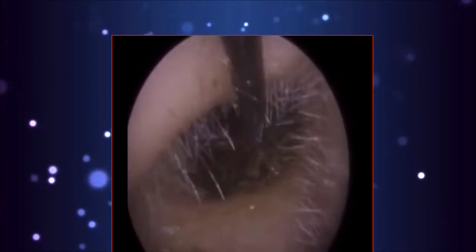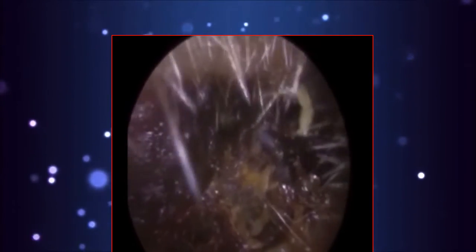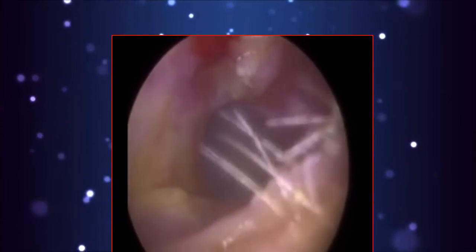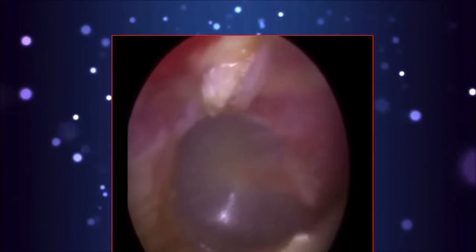And you'll see, so I think here we are now, we're in with the ear hook. So I'm actually inserting the hook anteriorly, so to the left hand side, to the front of the left ear canal. And as I'm removing this, you'll see I'm nowhere near the back canal wall. The ear hook is more in the middle and to the front, and we're near the entrance. I'm bringing this out, so I did not make any contact with the back canal wall, but you can see that's where the skin detached from. So the ear hook was nowhere near that. And there's no cut there, it's just basically skin that detached. It's more blistering than bleeding.